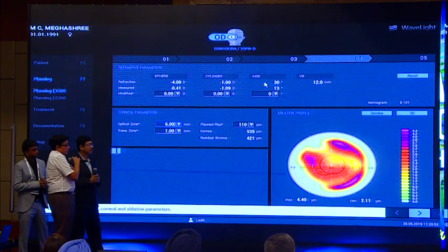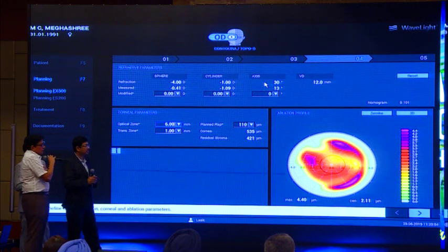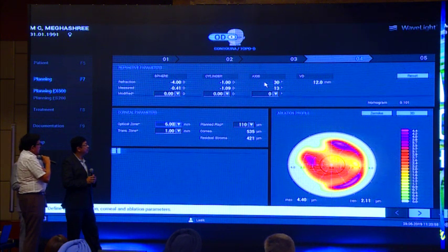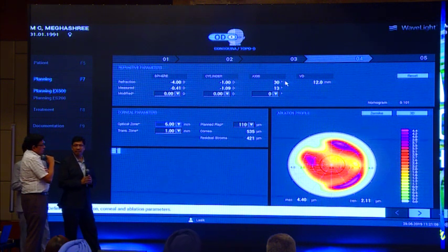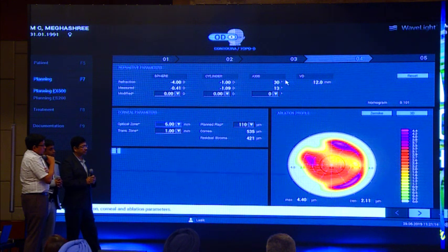I would have the patient re-refracted, to check whether the refraction was right. The second thing is whether the patient would accept a cylinder at about 15 degrees or so. If the patient doesn't accept the cylinder at 15 degrees on re-refraction, then probably I would treat as per the manifest refraction. That's what he said, 30. Dr. Jayant? Yeah, if he doesn't accept this cylinder, I also do the same, that we re-refract, and if the patient still doesn't accept emphatically, then I would definitely do it at 30 degrees.